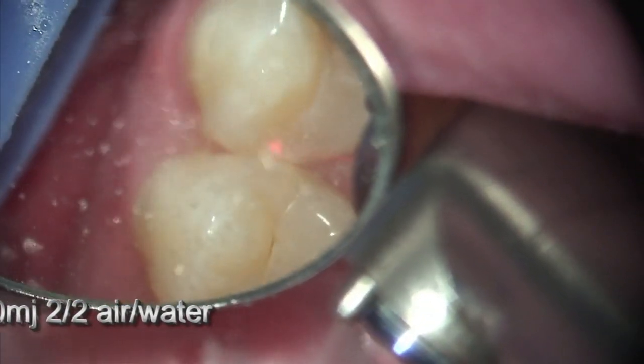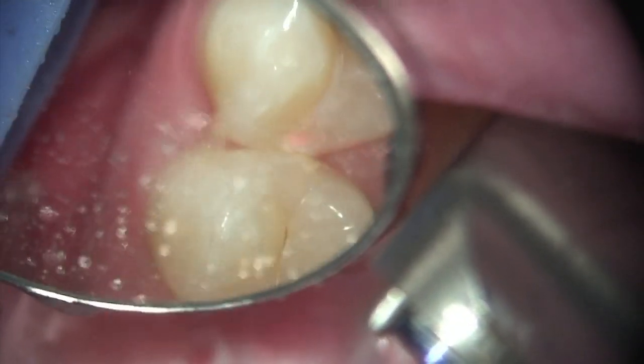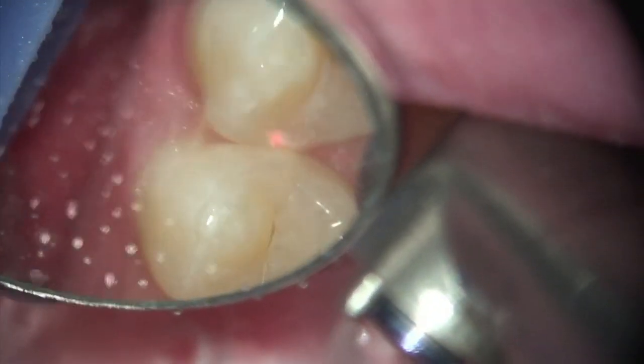Due to the histology and the way the enamel rods are placed, the laser is very efficient in a Class 2 preparation — no matter what the size.